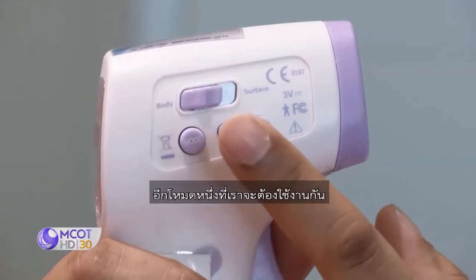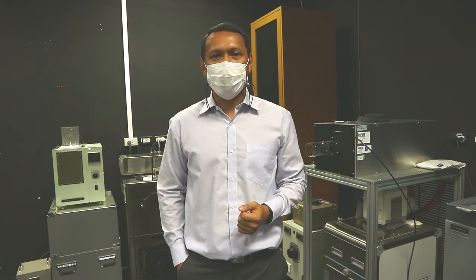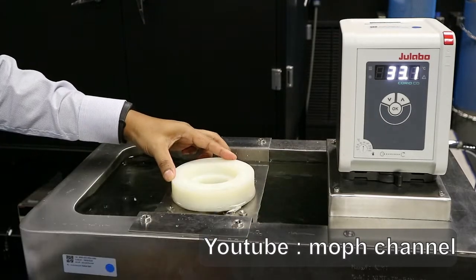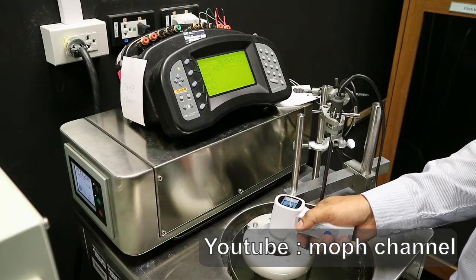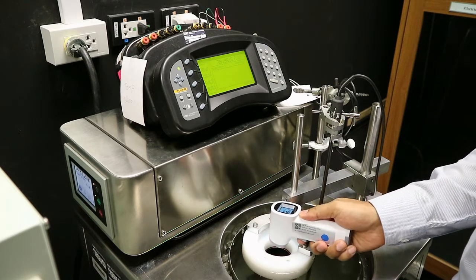As the COVID-19 pandemic continues, clinical thermometers are widely used to screen people, including skin infrared thermometers and thermal imagers. The accuracy of the thermometers should be verified by comparing their readings with a standard blackbody source, whose uncertainty should not be more than 70 millikelvin. At NIMT, we design and manufacture a portable standard blackbody source with high emissivity of 0.999 and uncertainty below 40 millikelvin. We use the standard blackbody sources to verify thermometers from hospitals and also distribute or sell them to secondary calibration laboratories in Thailand. So we use metrology to improve health for a better life.